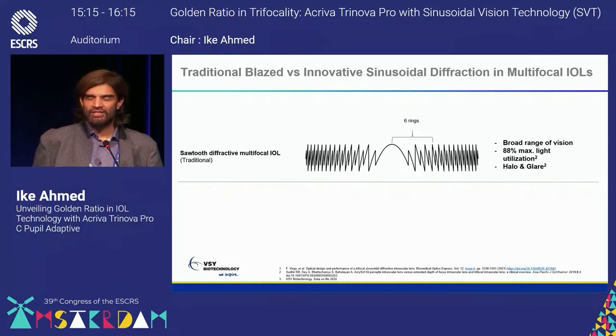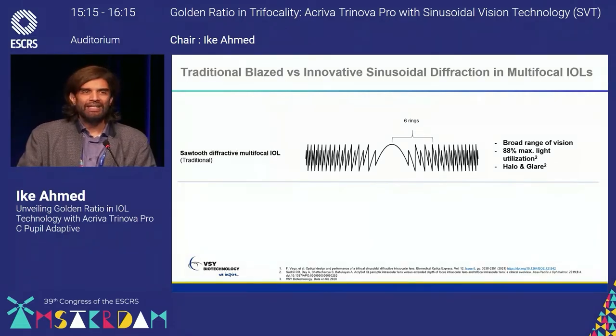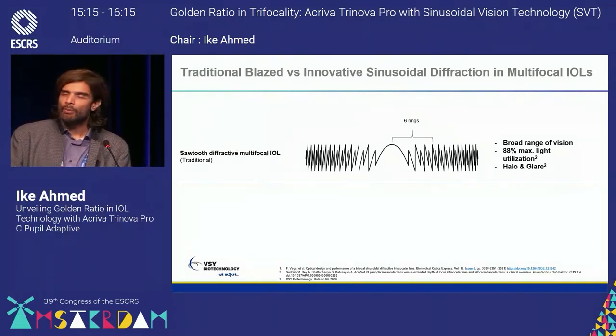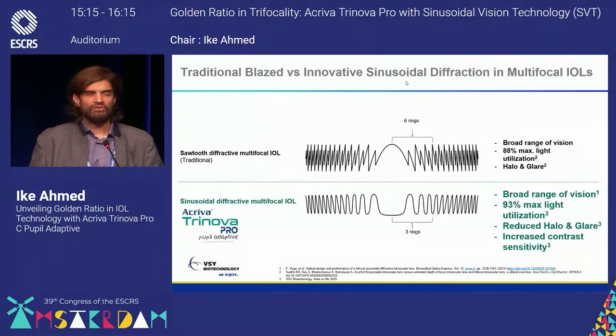You notice the six rings here. This does provide a broad range of vision. We know that. But we lose some light. We're down to about 88% maximum light transmission. That's all we can get from the lens. And this can create glare and halos, of course, and contrast loss.